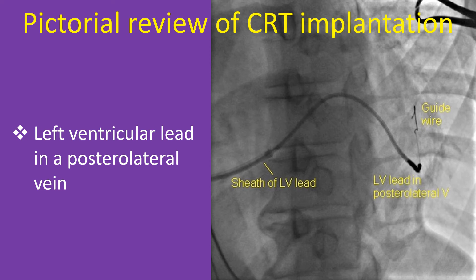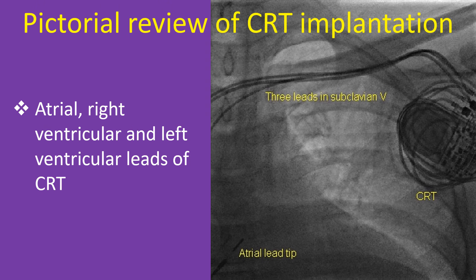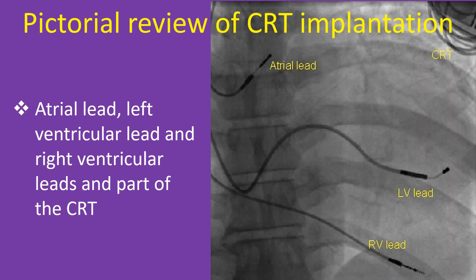The peel-away sheath can be split using the device provided in the kit once a stable lead position has been obtained and tested. The atrial lead can be introduced and positioned in the right atrial appendage. Proximal ends of all leads are connected to the appropriate ports of the CRT device. Three leads are seen in the left subclavian vein. The tip of the atrial lead is seen in the lower right corner. Redundant lead loops and the CRT device are seen in the left upper corner. The final picture after implantation shows both ventricular leads, the atrial lead, and part of the device in the upper left corner of the image.